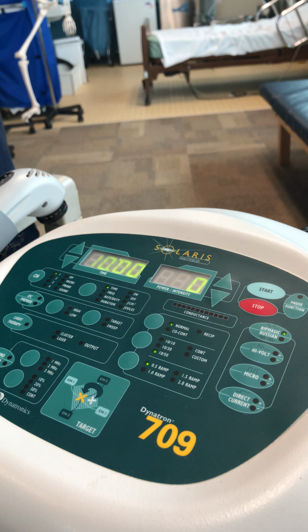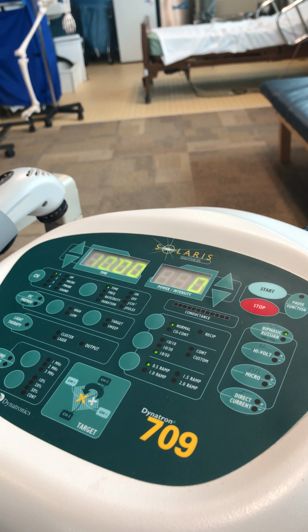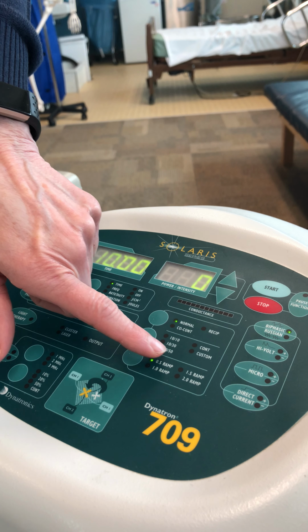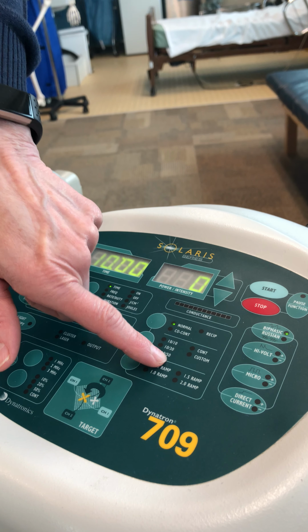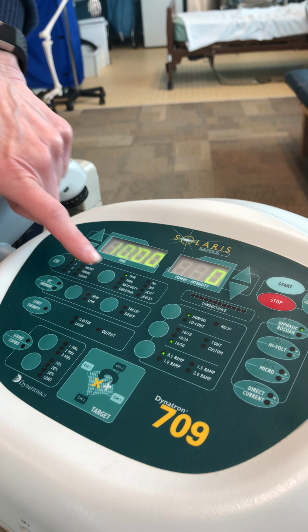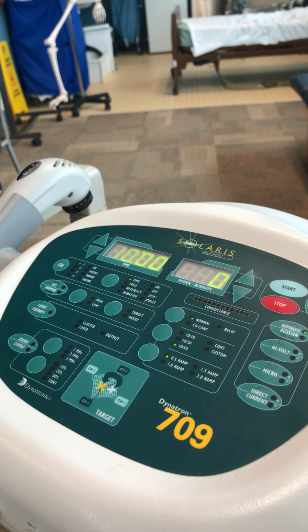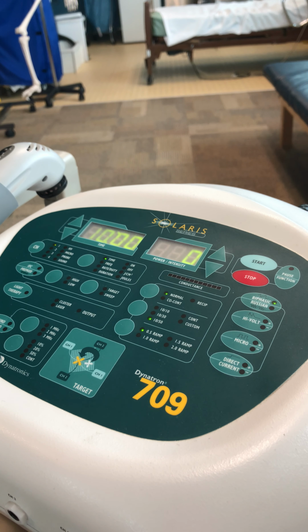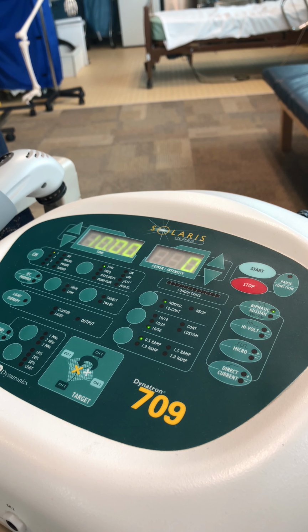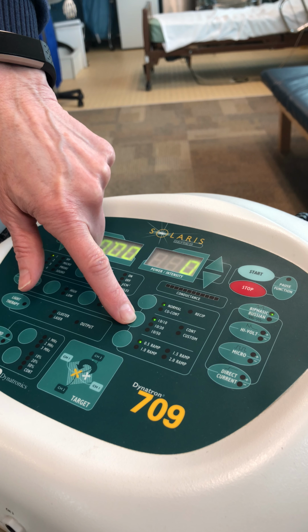For a demo, I'll probably do a 10-30, so we don't have to look at them for almost a whole minute. Do you see why the default setting is 10 minutes? They're assuming if you start with a 10-50, that's a total of 1 minute, so you're going to get 10 contractions. 10-10, we use to fatigue out a muscle, for the low back if someone has muscle spasm. But say we need to build up her biceps, I would start at 10-50, but for the demo we're going to do 10-30, okay?